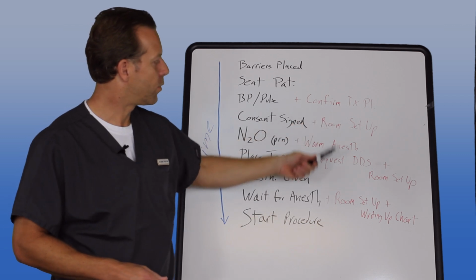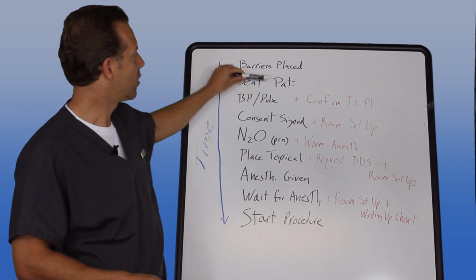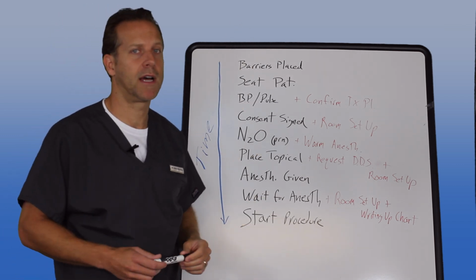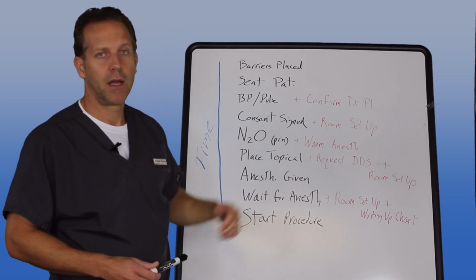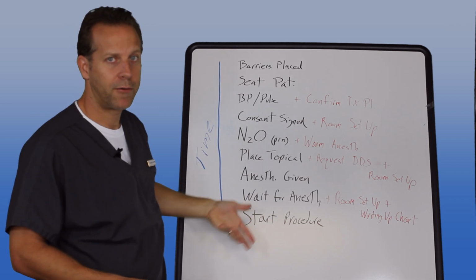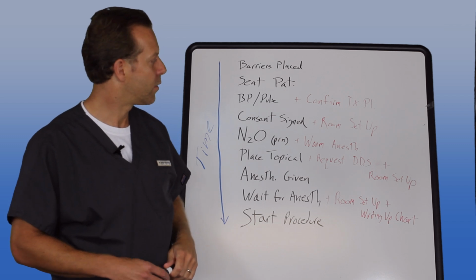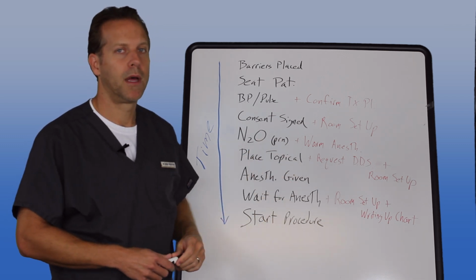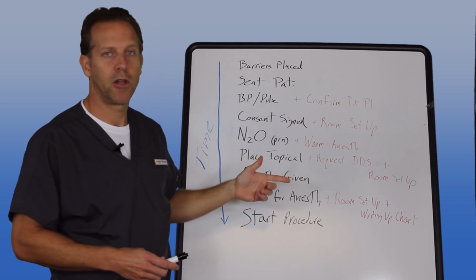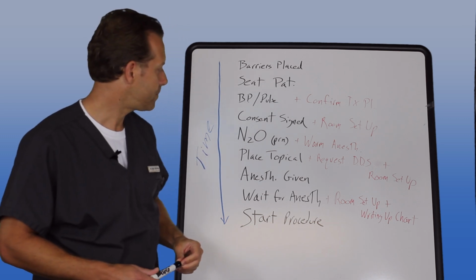We can just be setting up the room as all these different steps are proceeding. Some assistants like to get the room set up ahead of time, which is nice. Of course, if it's the first patient of the day, it should be set up ahead of time, but as the day progresses, the room can be set up while we're waiting for all these different things to occur, like waiting for anesthetic to take effect, waiting for the doctor to come in to actually give the anesthetic. So the room doesn't have to be completely set up before the procedure actually begins. And just knowing that one concept alone can help shave several minutes off of your setup appointment time.